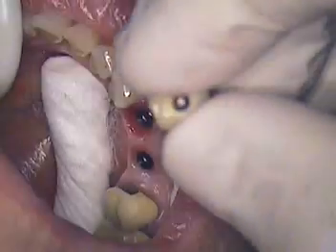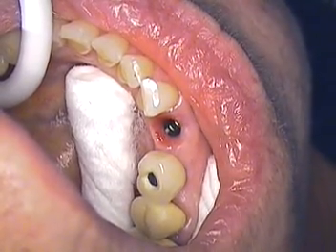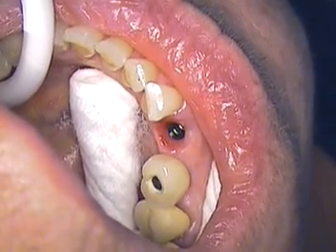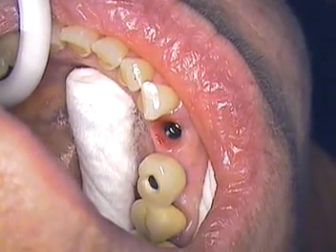Occlusion was checked, but we're a little high on the cuspid. We'll be adjusting the cuspid after we torque down to 35 newton centimeters. So I'm going to go ahead and torque in the first one. Again, we're using the Strauman system.